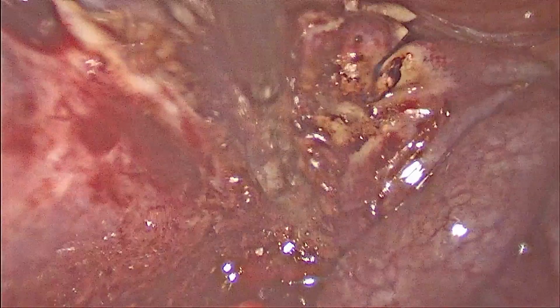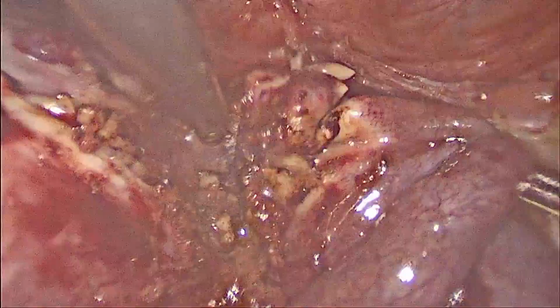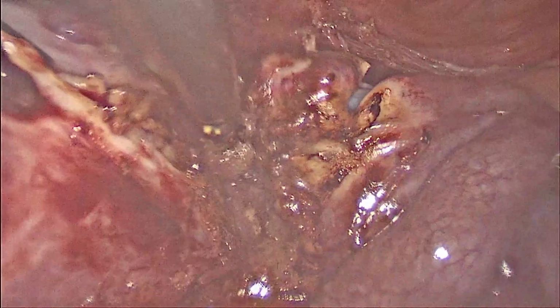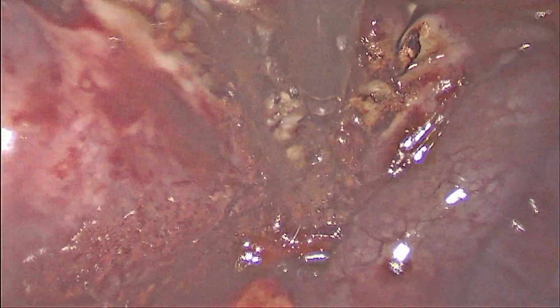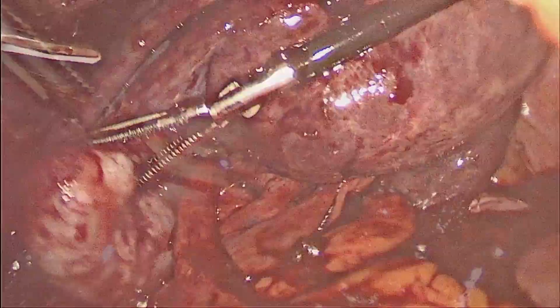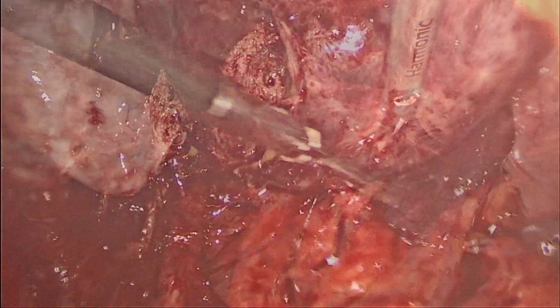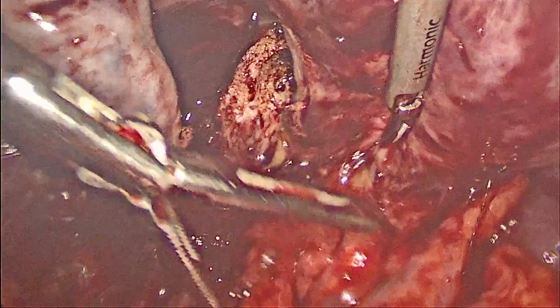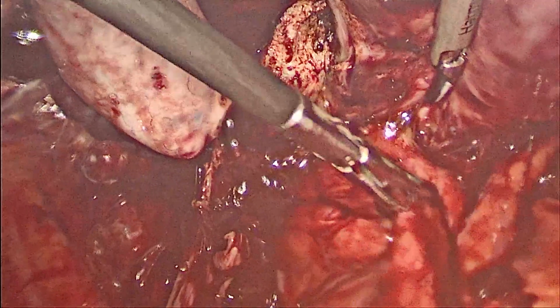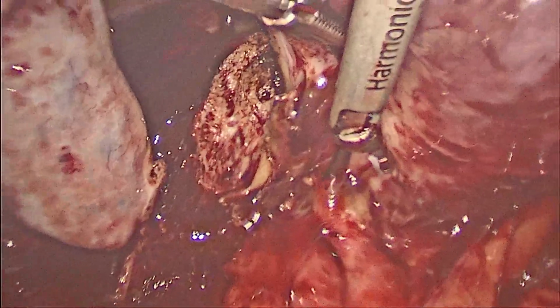There was a good amount of exposure available on the left side, but on the right side the adnexal tubo-ovarian mass is stuck and inflamed. When it is inflamed, you should be very careful in handling the bowel also. Care should be taken that we do not injure the bowel. We can see that the sigmoid colon is adhered to the posterior surface of the uterus, and it is obliterating the pouch of Douglas.